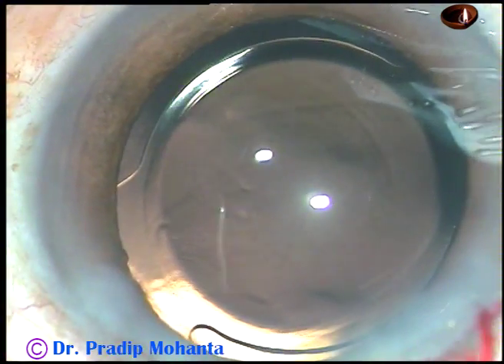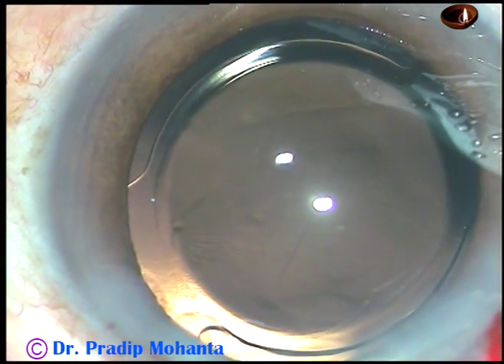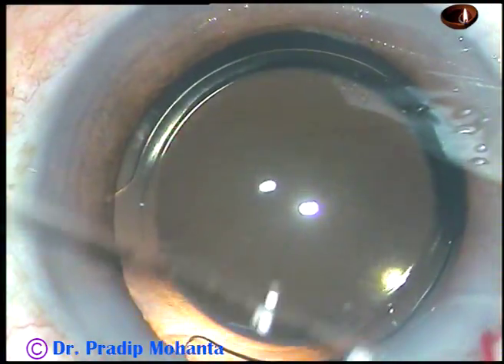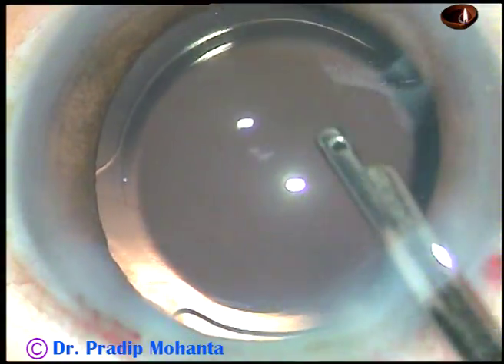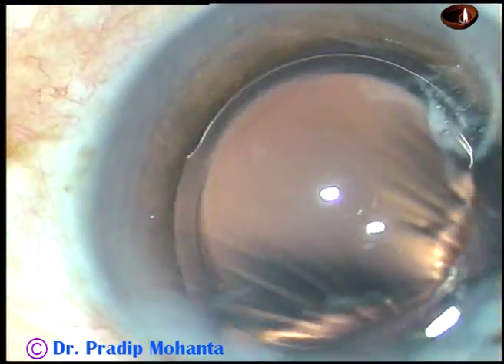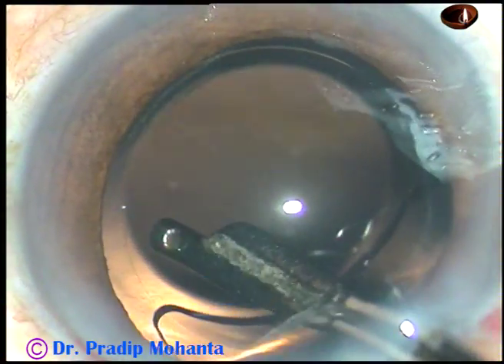The side port is hydrated — the stroma on either side of the side port is hydrated. Now this is the final lavage of the anterior chamber; whatever viscoelastic substance sticks to the corneal endothelium comes out.